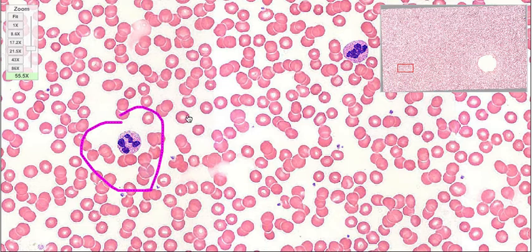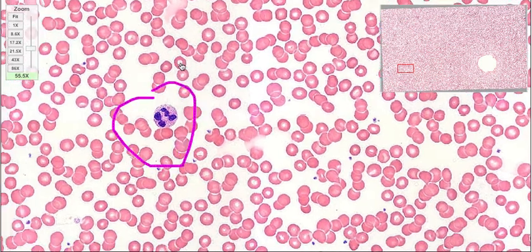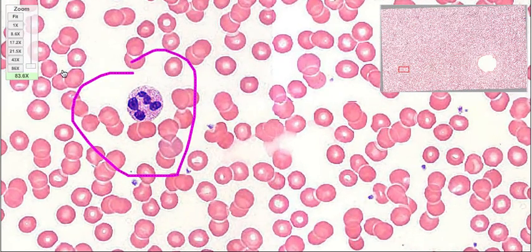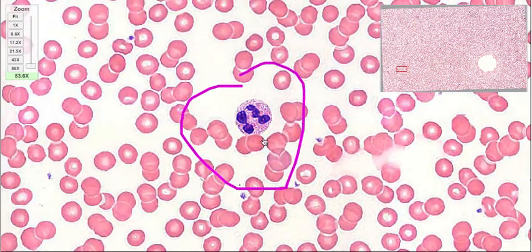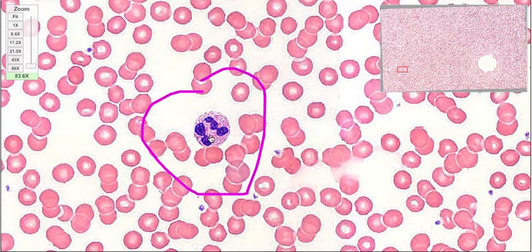They form the first part of the polymorphonuclear family, which is essentially, if we zoom in on this particular one that I've circled, cells that have a nucleus, but it's divided into many sections. So this is referred to as polymorphonuclear cells, and it's one of the three types you'll find in blood. They're granulated, so we can see these pink pigments within the cell that give it away.